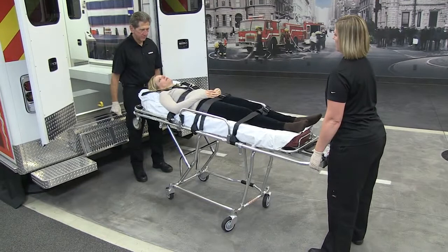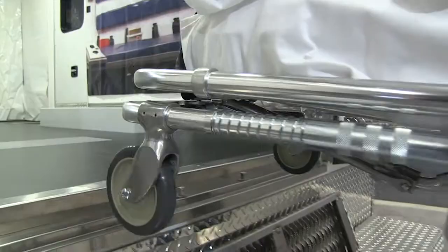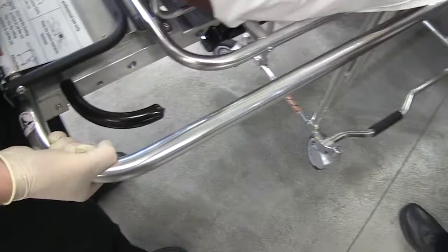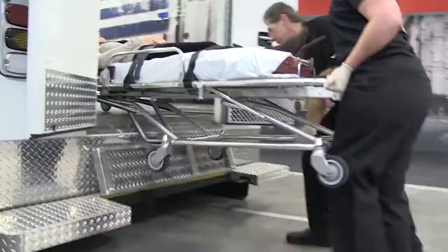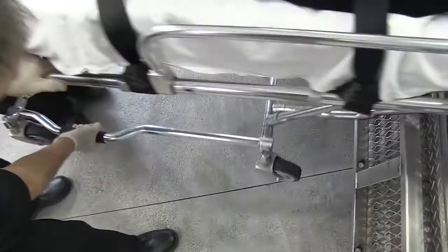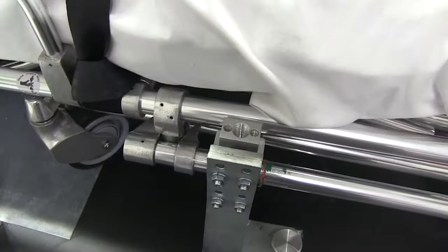The cot must be in the loading position to be loaded into the ambulance. Raise the cot to the loading position and roll the cot forward until the loading wheels are in the ambulance. Unlock the auxiliary lock. Lift the foot end of the unlocked cot. When all four transport wheels are at least two inches off the ground, squeeze the foot end control handle and push the cot into the ambulance. The undercarriage folds as the cot loads into the patient compartment. The operator at the head end assists by using the lift handle to help fold the undercarriage as the cot loads. Secure the cot in the crash-stable fastener in the patient compartment.